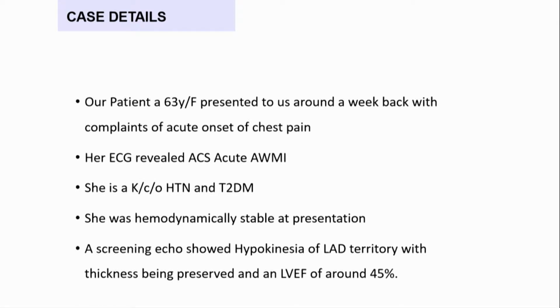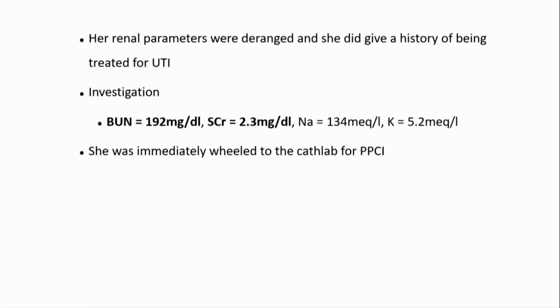We did the angioplasty to the LAD, and this patient also had a very tight and tortuous diagonal, which was almost like a 99% CTO of diagonal. So we deferred the procedure for the diagonal, and the nephrologists were involved. She was put on N-acetylcysteine, and over a few days, her creatinine has stabilized to normal now.